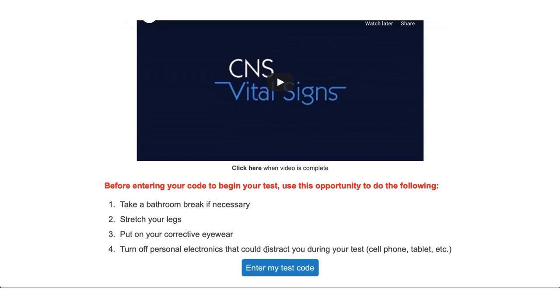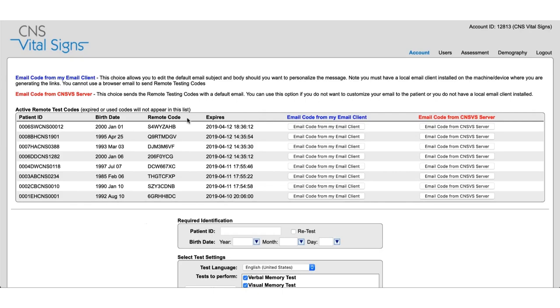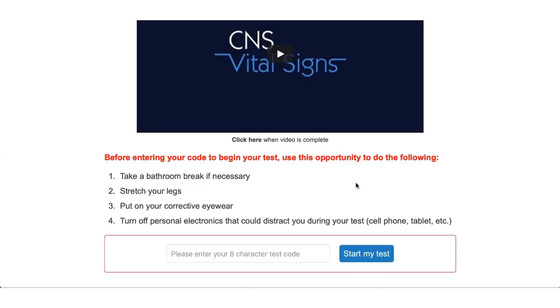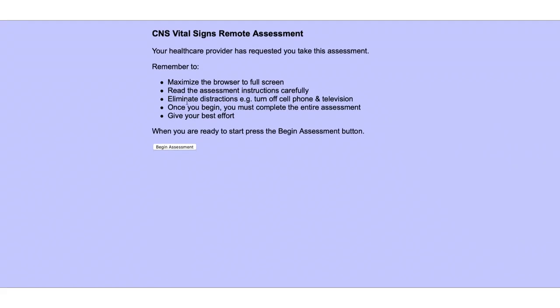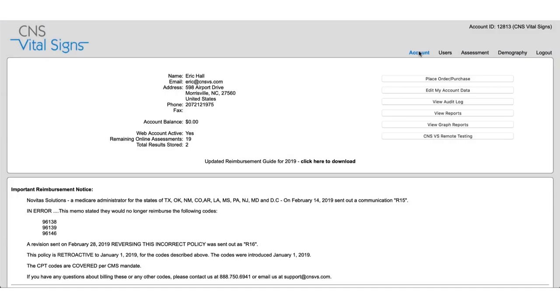There's a little bit more information right before they start the test and there's an enter my test code at which point the test taker will enter their remote test code that you can give them over the phone. Please note this is not case sensitive so this could be uppercase or lowercase and it will still work. And finally once everything's entered the test taker can just press start my test which will take them to the CNSVS site and they can begin their assessment.